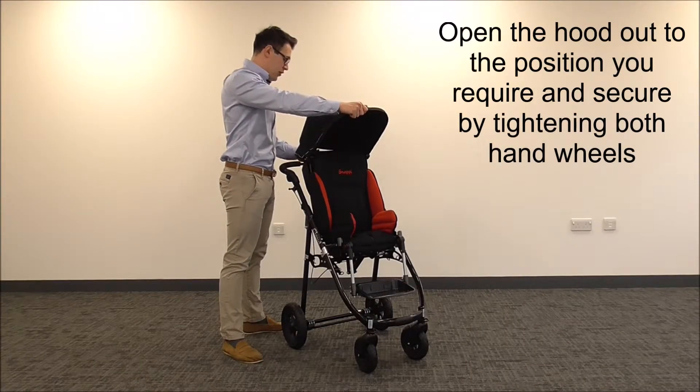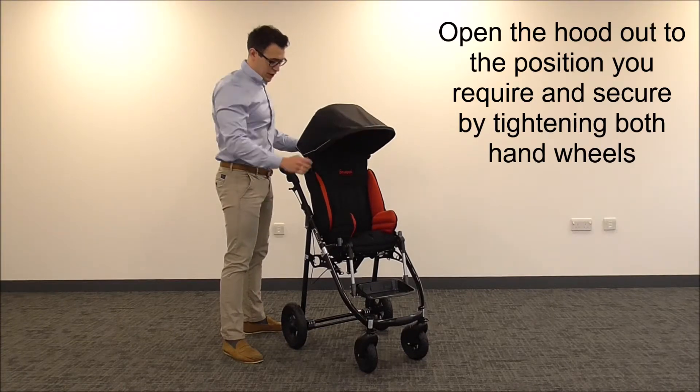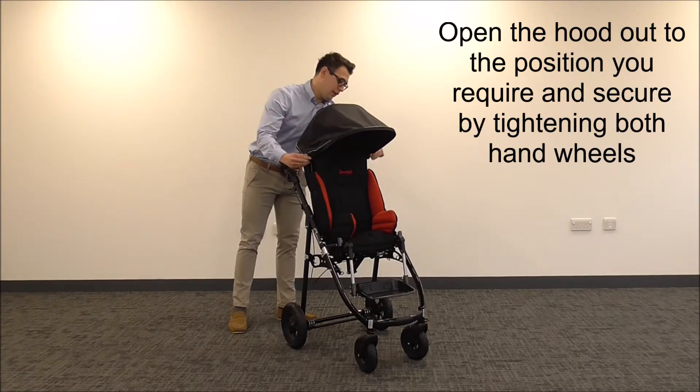Now open the Sunhood out with the viewing slot at the back and move it to the position you require. When you have the position, tighten the hand wheels on the side to make it secure.